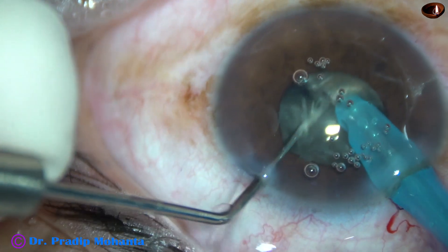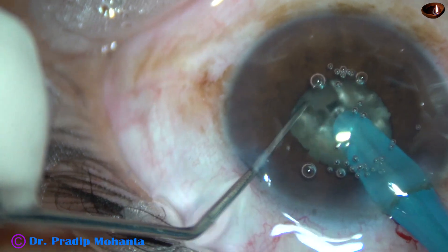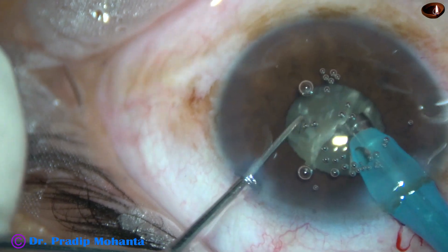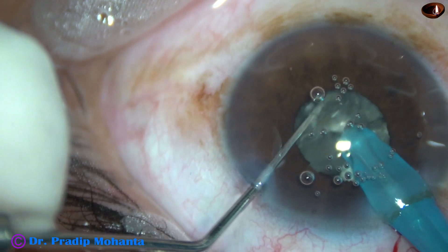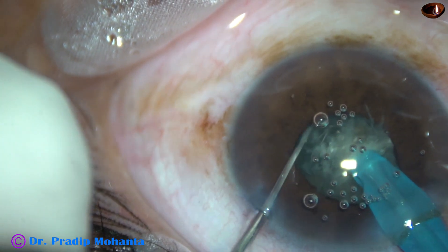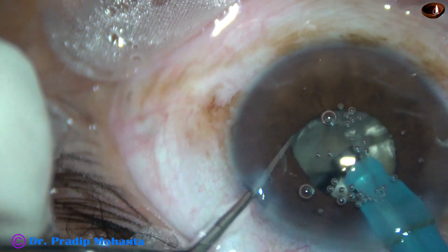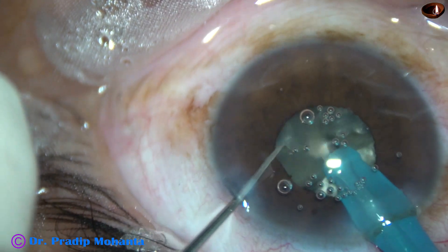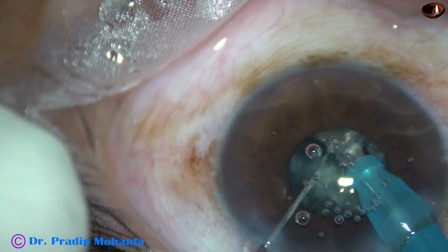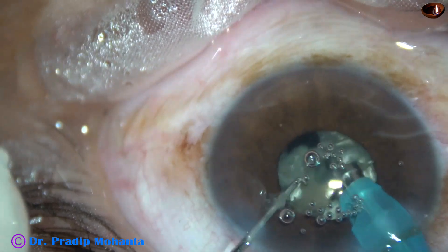Since I have very good experience with this technique — submarine chop — I could divide the nucleus into two hemi-nuclei. Now I am going to divide this hemi-nucleus into two halves. It is done. And now this fragment is quite large, so I am going to divide this fragment into two pieces. Now I start emulsifying these three fragments.